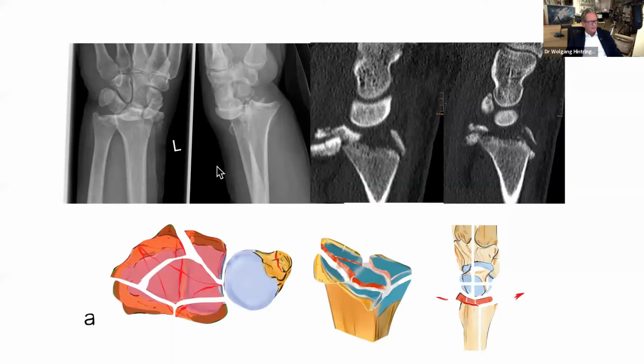As you can see here, it is not a really funny case because it's one of those fracture types which are already described. It is a non-key type fracture, a shearing fracture, where you have fragments which are not in conjunction with ligaments. Some are key fragments, dorsal or volar, but other ones are dropped out of the articular surface.